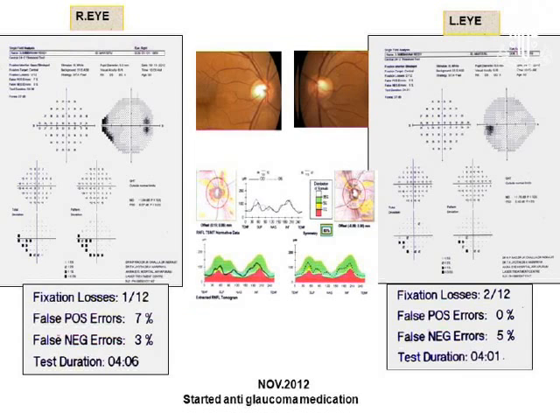He is carrying the visual fields and OCT. One area is showing a dip in the red zone, and a localized scotoma fulfilling Anderson's criteria, and a reasonably good, well done test, so they started the treatment.